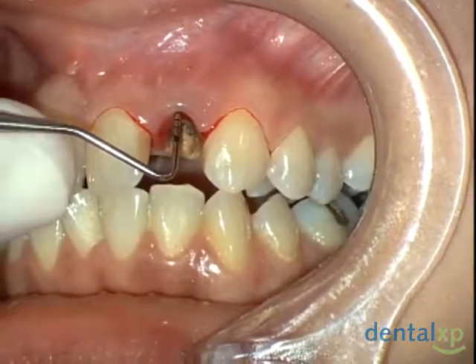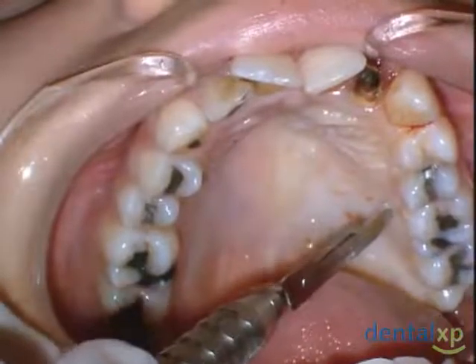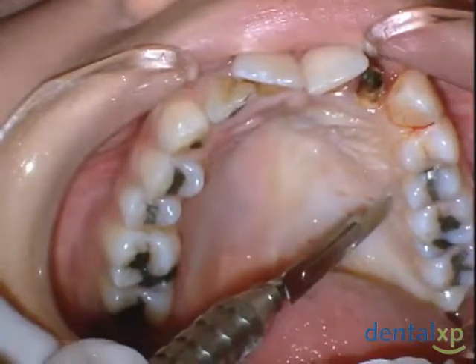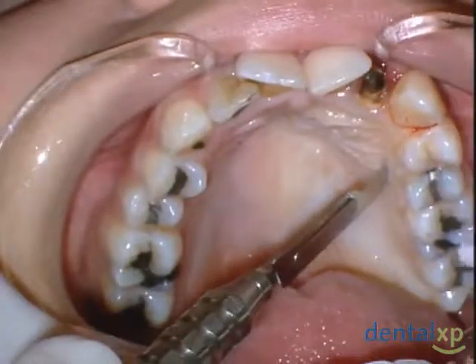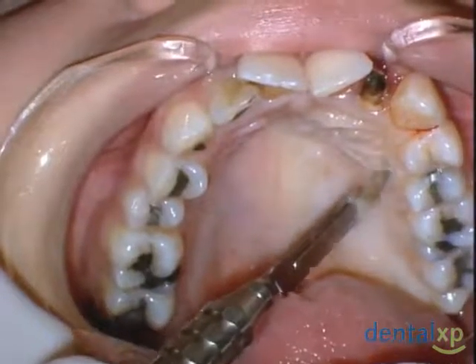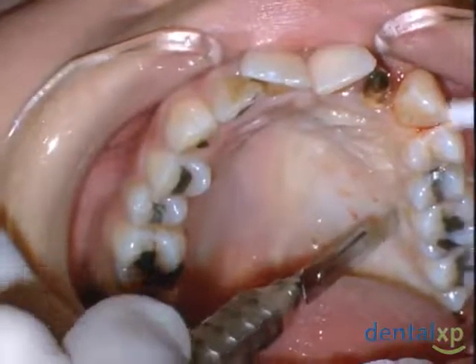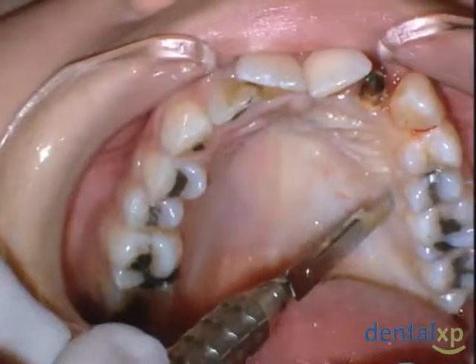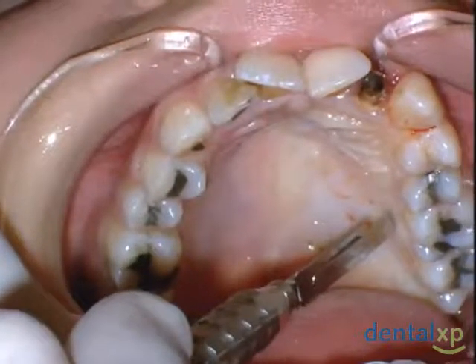You can see also the bone sounding on the facial exposed a very significant facial bony defect, and we are going to compensate for that with bone augmentation as well as soft tissue grafting. And as you can see here, we're going to first proceed prior to the extraction to harvest connective tissue from the maxillary left palatal region.